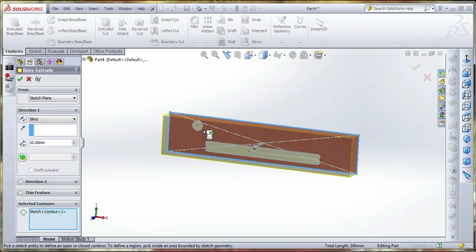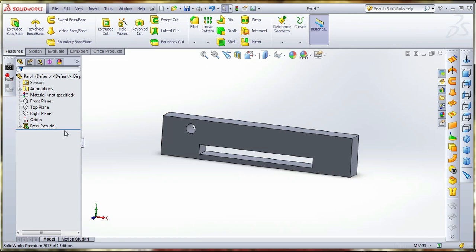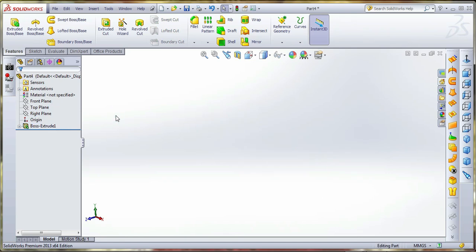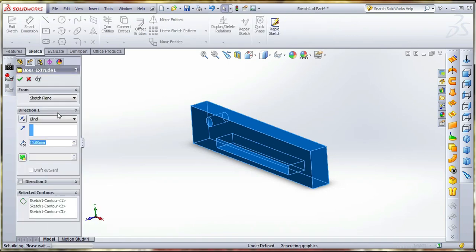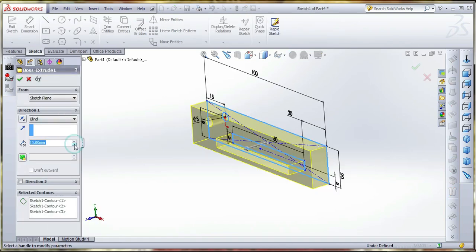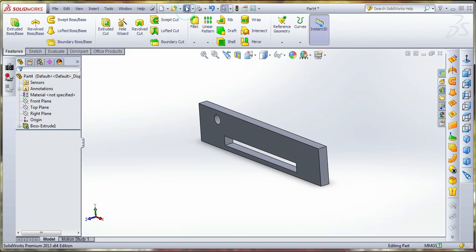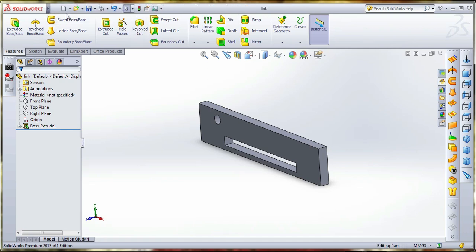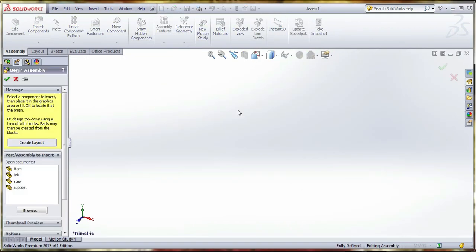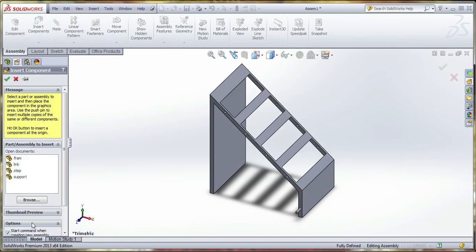So to extrude, first we will select the inner holes. This thickness can be reduced. Left click, select and edit. Thickness is 5. Okay, now going to make the assembly. This is step.